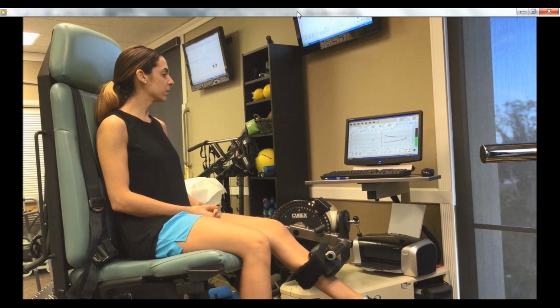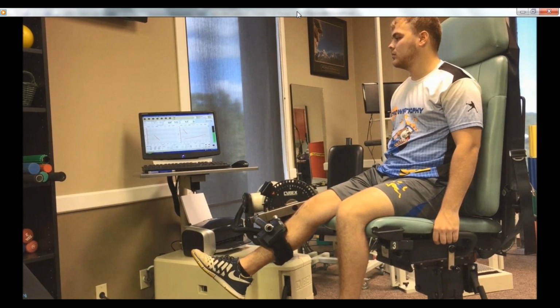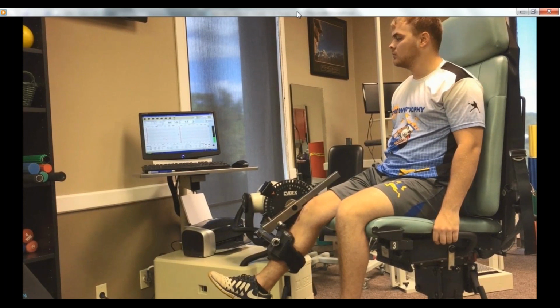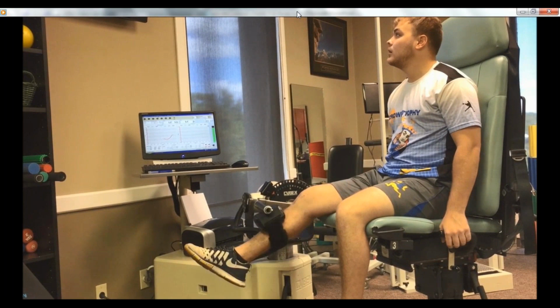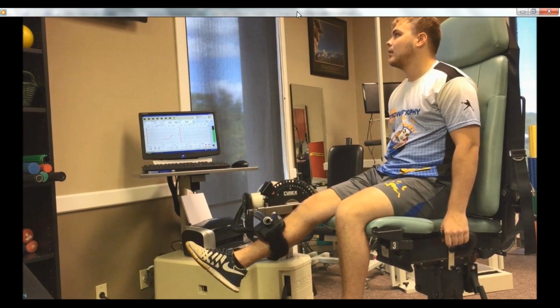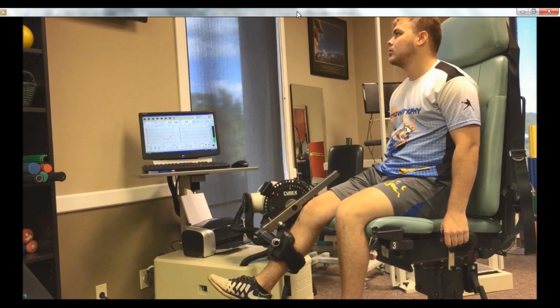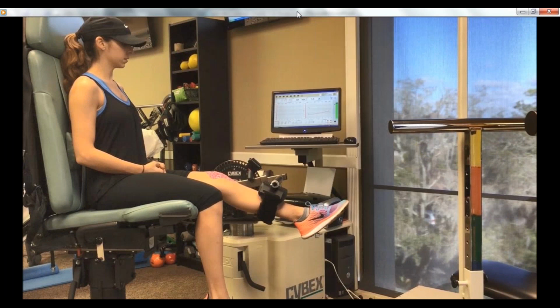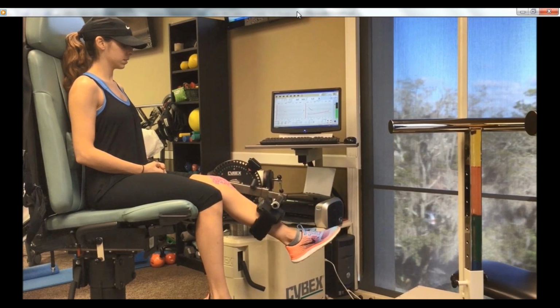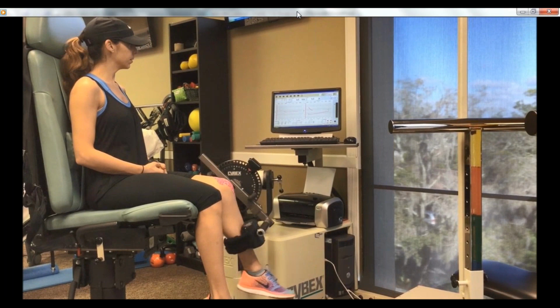So next, our athlete here, the eccentric exercising speed is 10 degrees per second, and the resting concentric speed, like John said, is double that, 20 degrees per second. So when he names these protocols, he's naming it for that concentric 20 degrees per second. So next, she's eccentrically contracting at 15 degrees per second and resting at 30 degrees per second. So you can see that we're moving our way along.